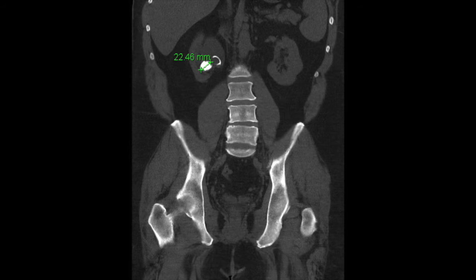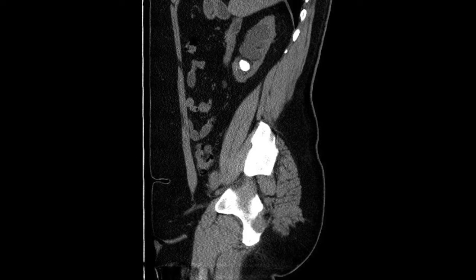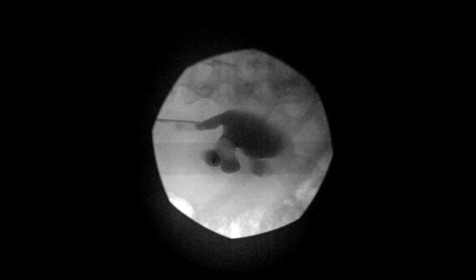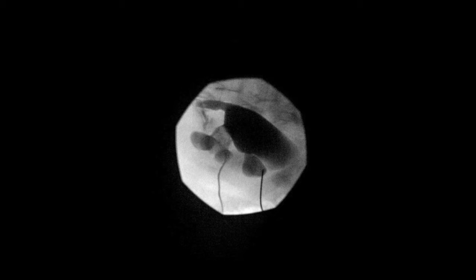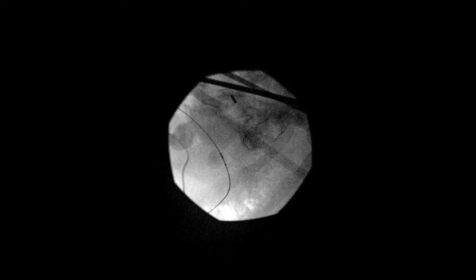In this particular case, a lower pole access would be the optimal place to enter in order to clear this large burden of stone from both the lower pole and the upper ureter. When we started to perform this procedure, however, it became obvious that the stone was stuck in a lower pole infundibulum, and even though access in the lower pole appeared ideal, we couldn't get a wire to go past the stone. With our primary access site being inaccessible, we then went on to a secondary site, which in this particular case was in an interpolar location. Even though we didn't plan to do this case through the interpolar calyx, this proved to be an excellent site to access the kidney, and we were able to render the patient stone-free at the end of the procedure.